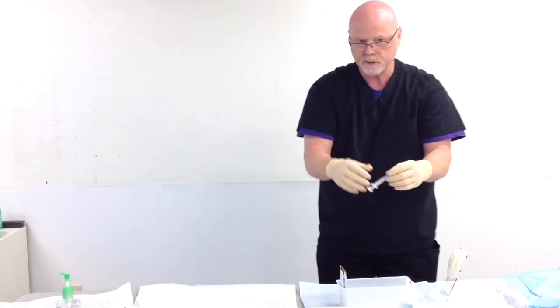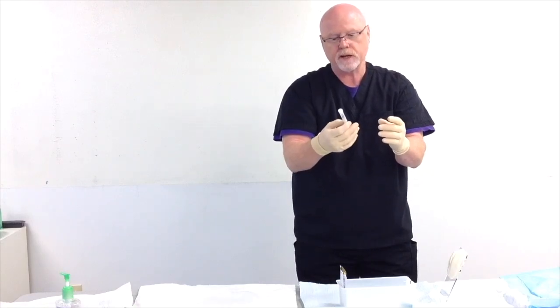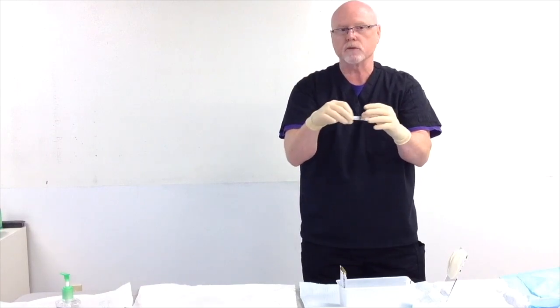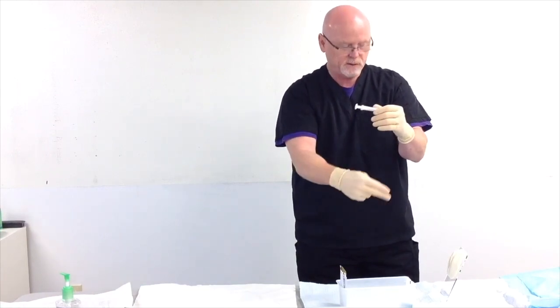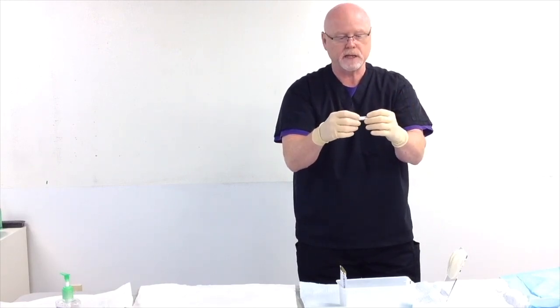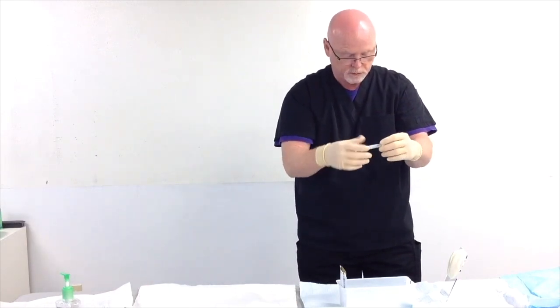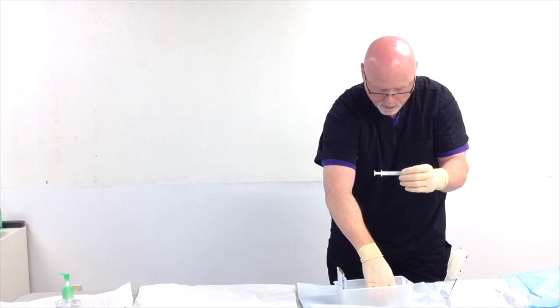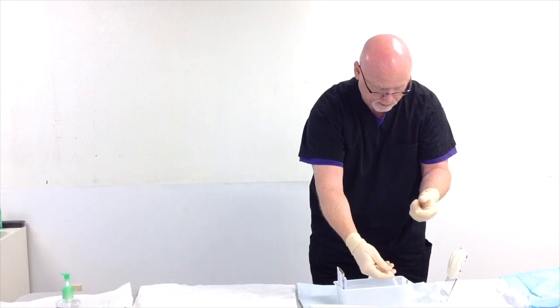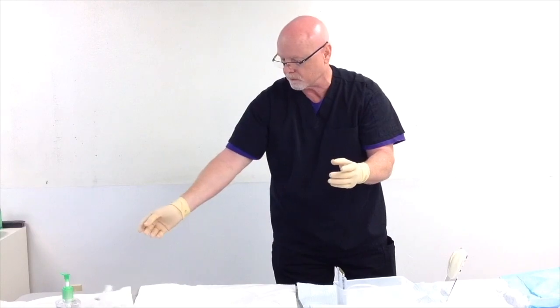Now, these are prepackaged for Excelsior, exactly the way they want them done. And you're going to have 1 to 3 mL of water inside of your syringe. They don't use lubrication because lubrication has a tendency to tear up these latex mannequins. And because of that, it's just going to be water in a syringe like this. So all you're going to have to do is pick this syringe up, orient the cath properly, lubricate the tip of this cath, and this can go in the trash can.